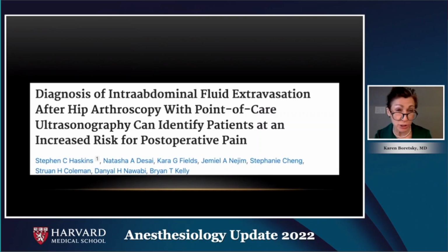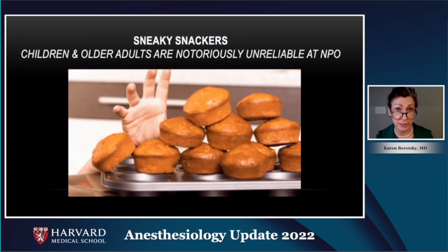Another use of intra-abdominal ultrasound after hip arthroscopy is for patients who have a lot of fluid extravasation or are at higher risk for increased postoperative pain. This can be determined using point of care ultrasound and quantifying the amount of fluid that is present.